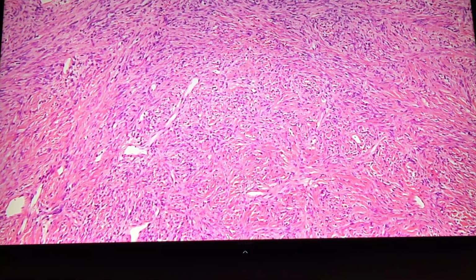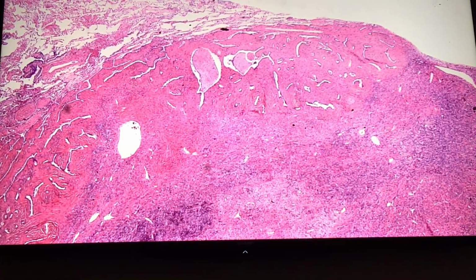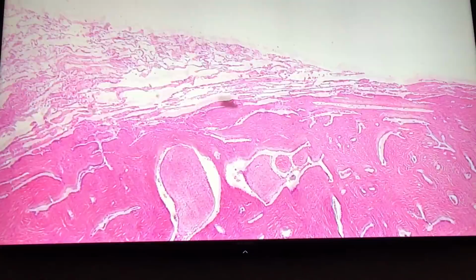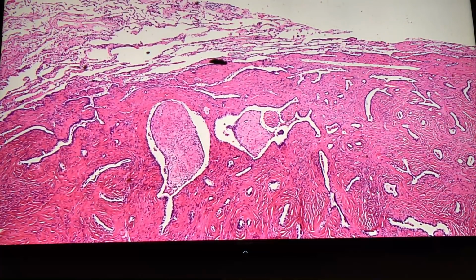So go ultra low mag, Aaron, and just show them what the lesion is doing. Is it a mass? It is, right? It's in the lung. What's happening at the periphery there, on the top left? That looks different. Maybe interacting with some normal lung. Yes, very good. So it is a low-grade lesion that is entrapping normal lung. And see how florid and complex it looks when it gets entrapped. So you already know because of that the lesion is probably a low-grade, slow-growing lesion.